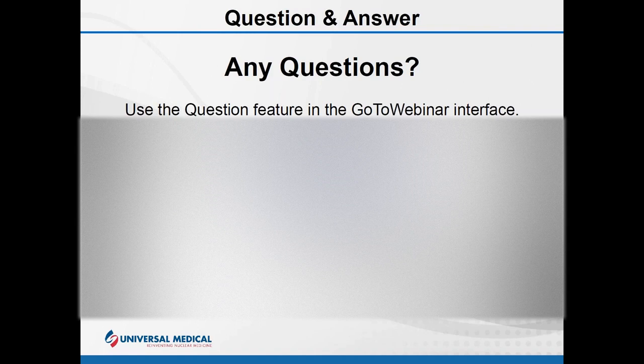In positron, or in PET scan, the P in PET is for positron. And in a positron emission, it actually goes out 180 degrees from each other. So if I have an emission that is going up and to the right, there's an exact simultaneous emission going down and to the left, 180 degrees apart from each other. By using detectors that are timed very, very critically, I can see where those 2 hit on the detection ring.